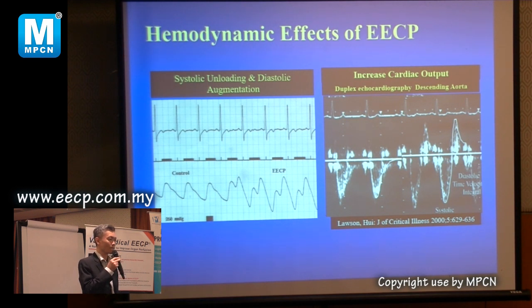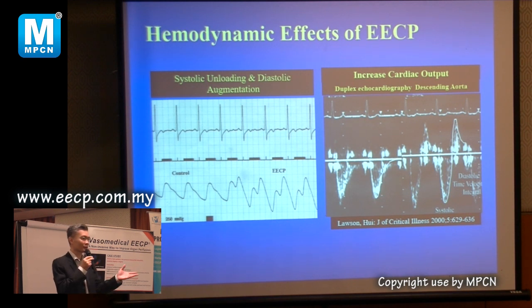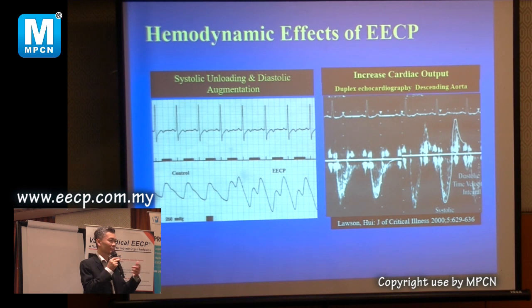It says 5 days per week. Why can't we do 7 days a week? You can, if the center is open. It's even better if you do it every day, continuously. The center must be open for you. After that, it's just opinion, not based on facts. The 35 sessions are based on facts. After that, nobody knows what is the best.